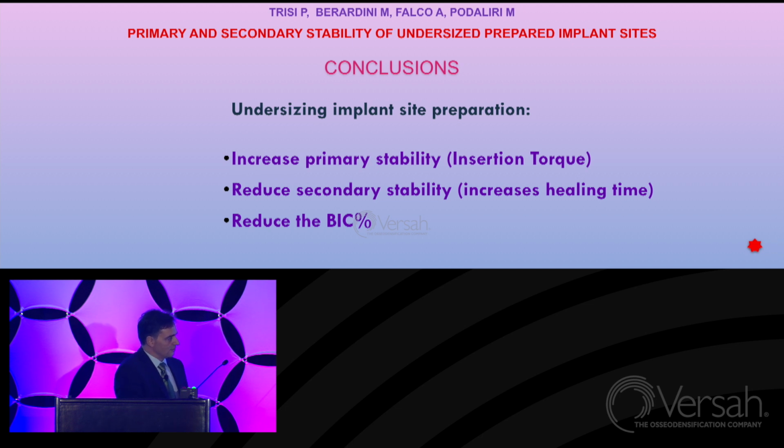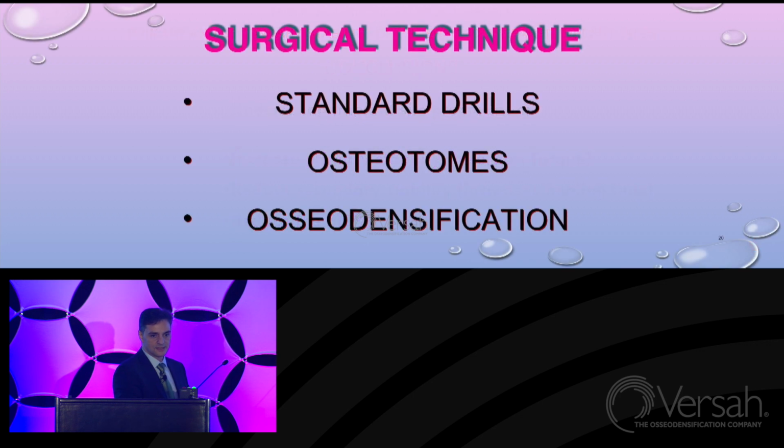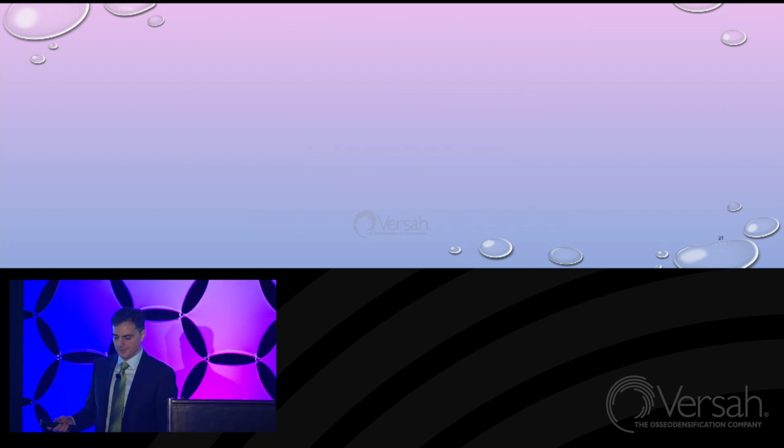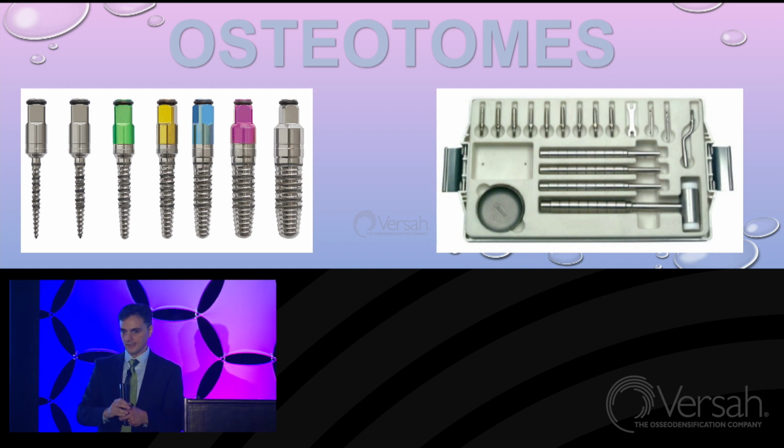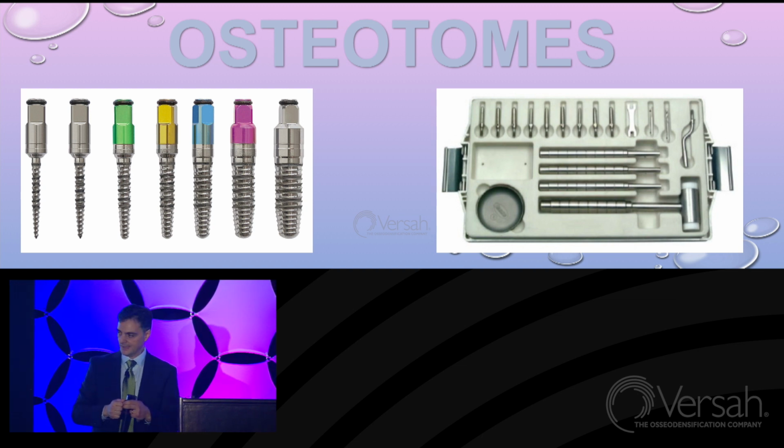So going now to talk about osteotomes. This is what I have been using in the last 10 years in the upper jaw, the maxilla. I stopped using the drills. I usually use only a 0.8 initial drill, and then I shift to this type of osteotome, which are screw osteotomes.